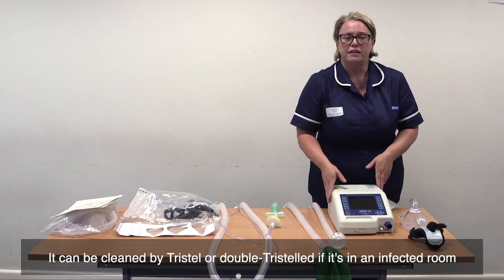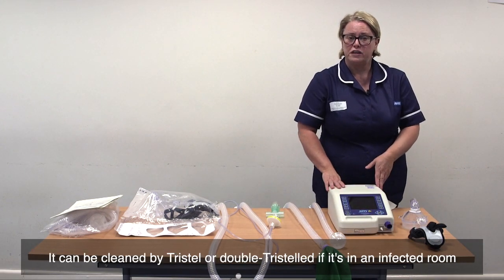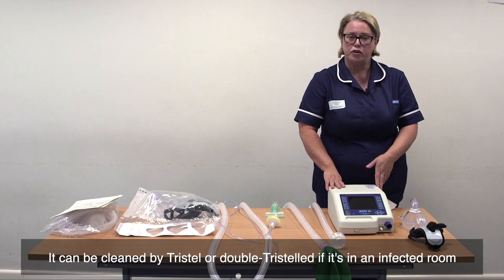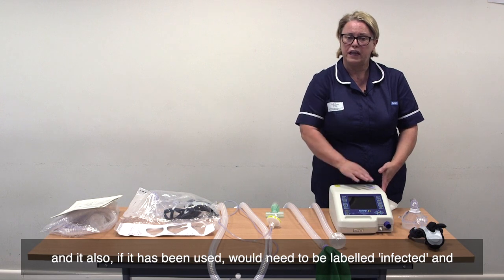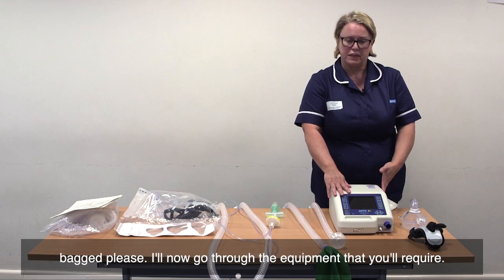It can be cleaned by Tristel, or double-Tristelled if it's in an infected room. And if it has been used, it would need to be labelled, infected and bagged, please.